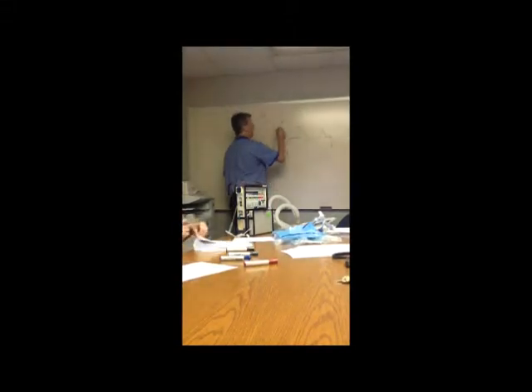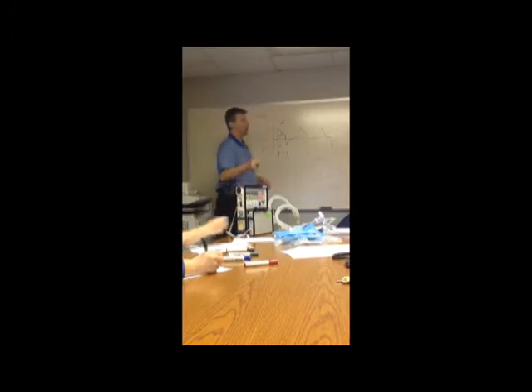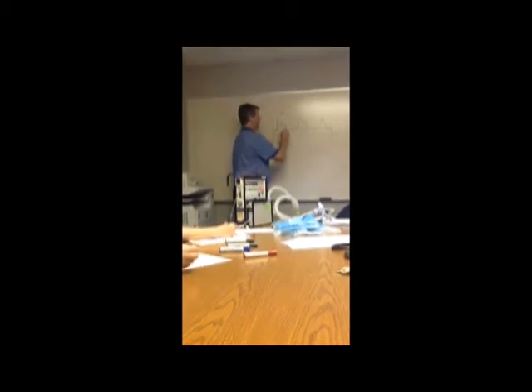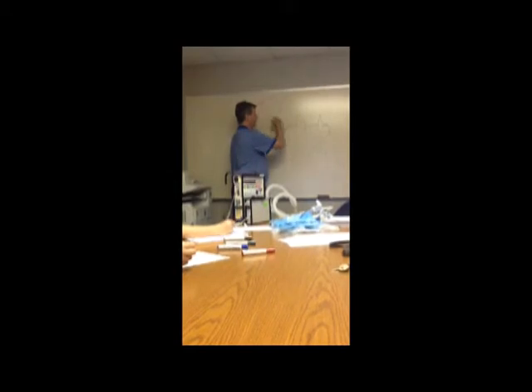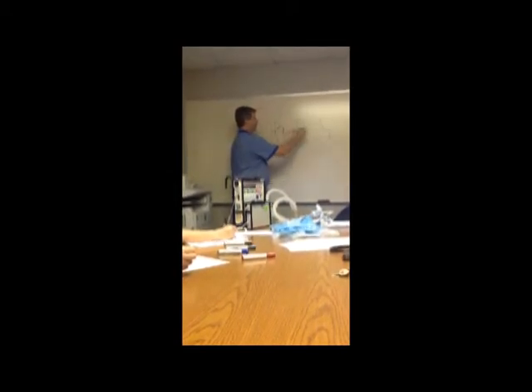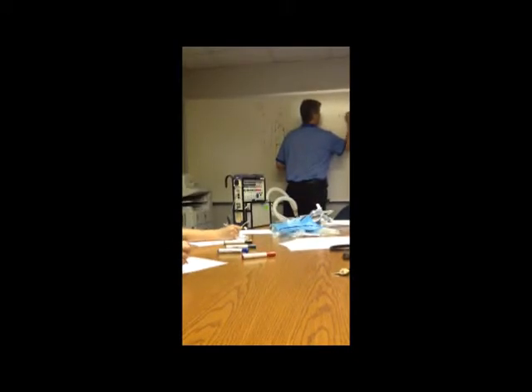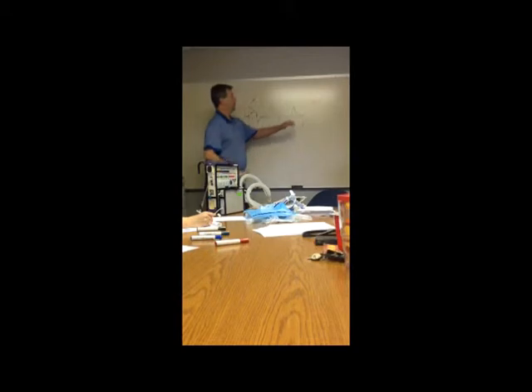All right, so that's assist control, basically. That's the breath pattern for assist control. All right, and we're going to talk about pressure and volume control in a little bit, but not yet. Just to say a few words, the difference is volume ventilation delivers a set volume with a set flow in. This is assist control. You can have assist control VC. That's assist control, volume control.